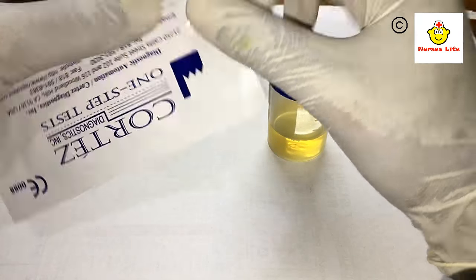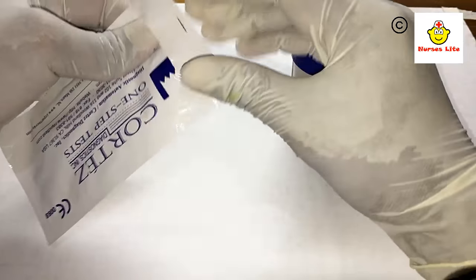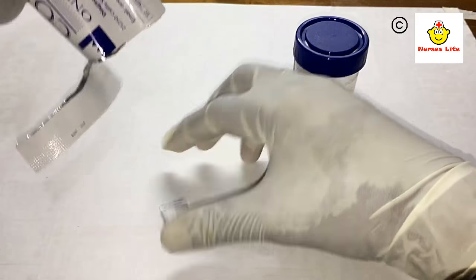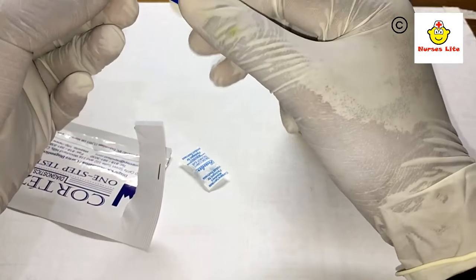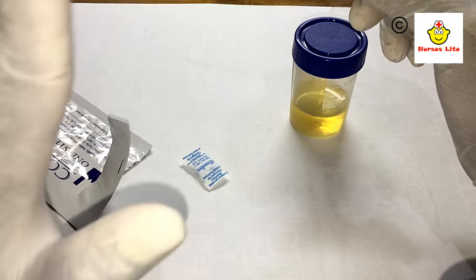The first step is to tear open this pack. Inside this bag there is a desiccant and also the strip that we need. This is the strip we will use for the test.